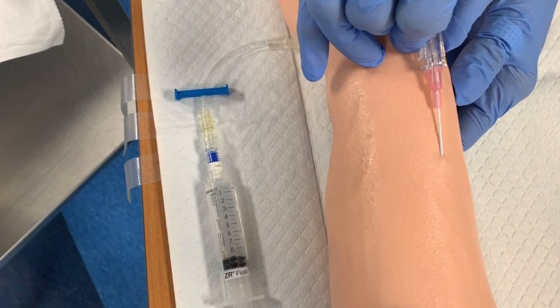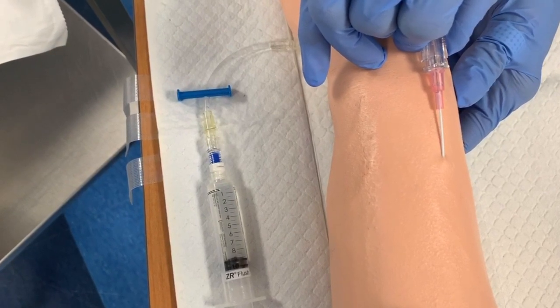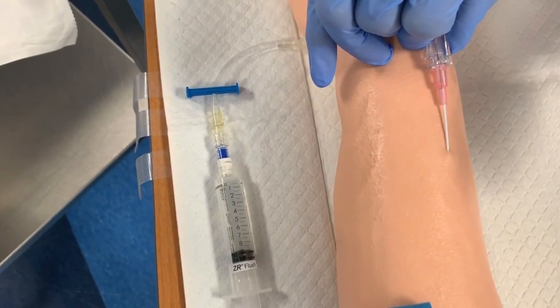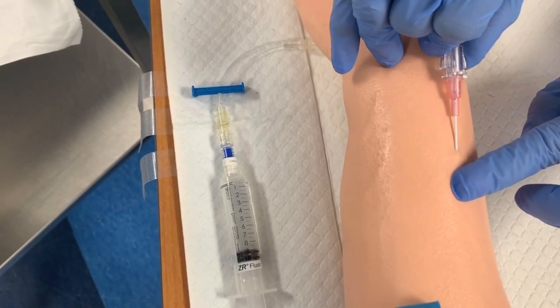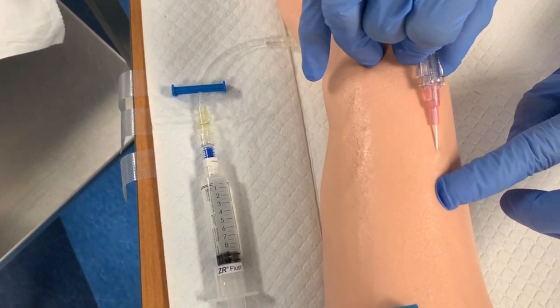Once you get that bevel under the skin, that's the hard part. Now you can breathe, and now, as long as I don't touch the catheter, I can bring my hand up and kind of help guide where my catheter is going to go.